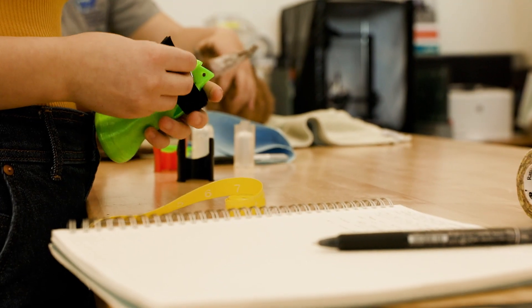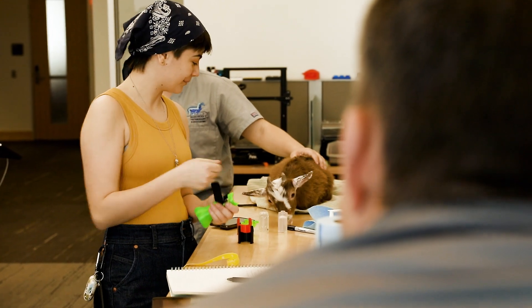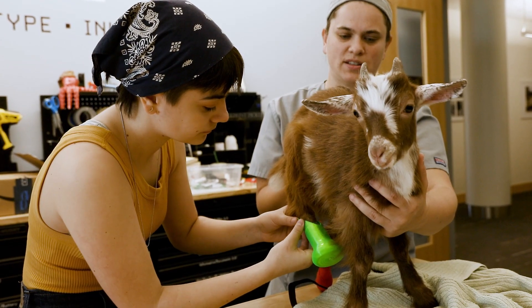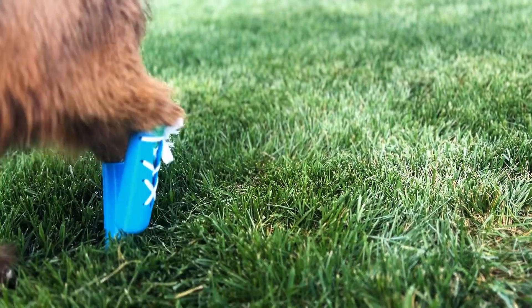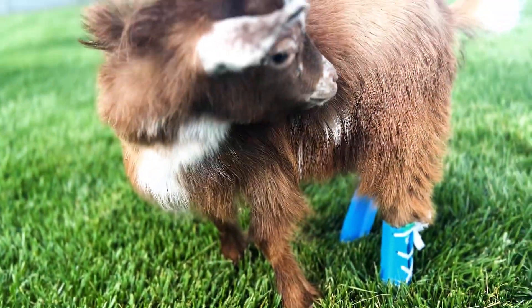We were able to reach out to other departments with specific expertise and collaborated together to come up with a really good solution. That was our first time getting all these different units together to actually solve the problem. We ended up with a prosthetic style that was a bit like a shoelace or corset that you could tighten at different sections and have different thicknesses.